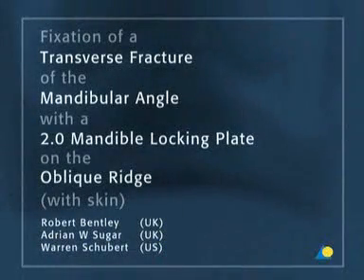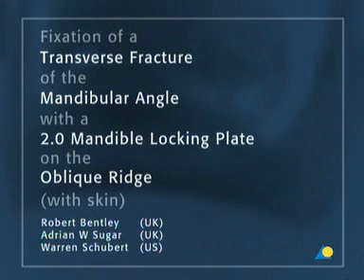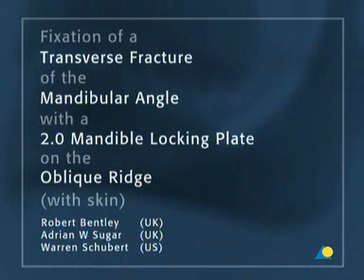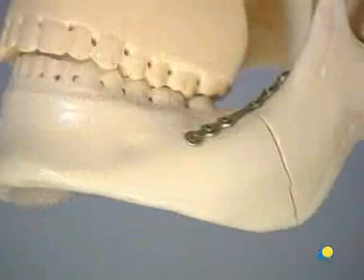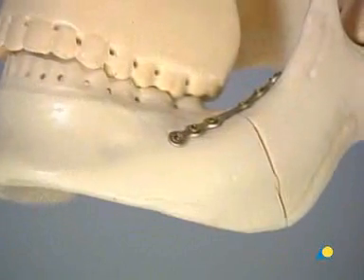A transverse fracture of the mandibular angle is treated with a 2.0 mandible locking plate, positioned on the oblique ridge, as described by Champy.